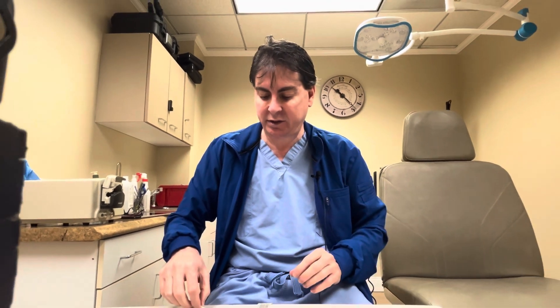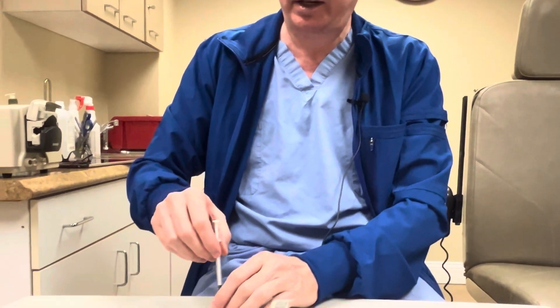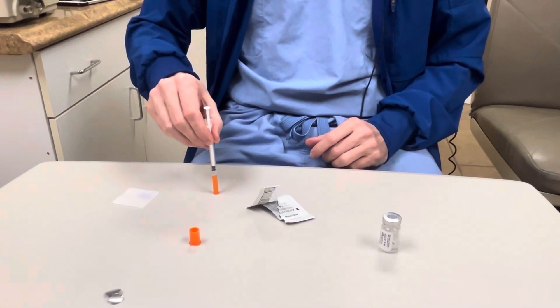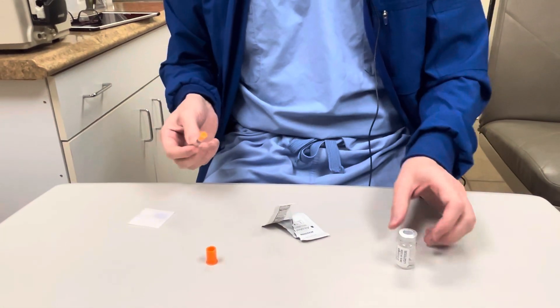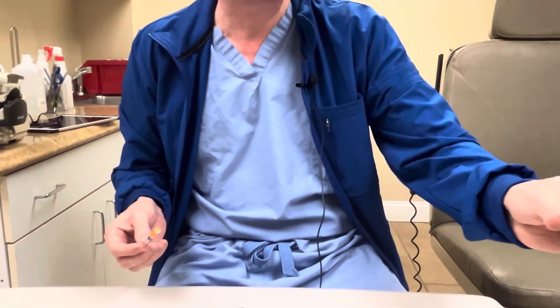Once you're done you can throw the syringe into a sharps container. If you don't have a sharps container, you will want to recap so nobody around you sticks themselves. The cap has two ends — the proper way to recap is not to hold it in your hand; instead, set the cap on a table and use the table as your friend to guide the needle in safely. Then you can throw it out and stick the product back in the refrigerator.